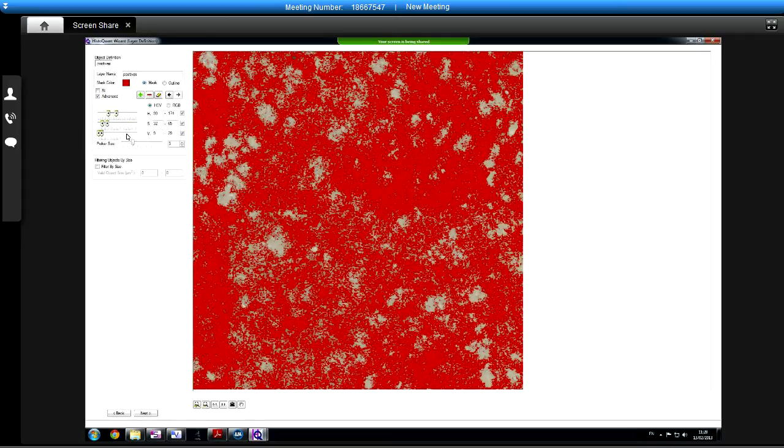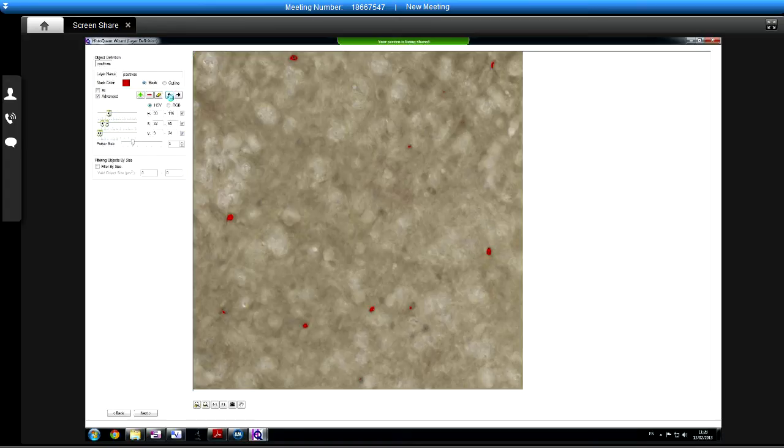So what you see here are these backwards and forward buttons, just like in Word, etc. If I just click back there, we'll go back, and I'll keep going back, obviously, all the way to the beginning. And I can go forward as far as I was before.